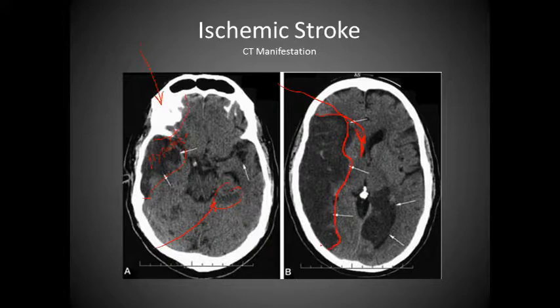We have a large ischemic stroke comprising probably 1/3 of the parietal lobe. And notice we have possibly edema or another ischemic stroke here on the opposite side. So basically, because we're seeing this in the right side, a patient is probably having left-sided weakness, left-sided abnormalities.